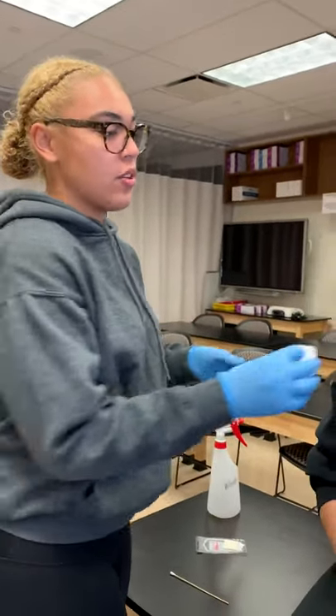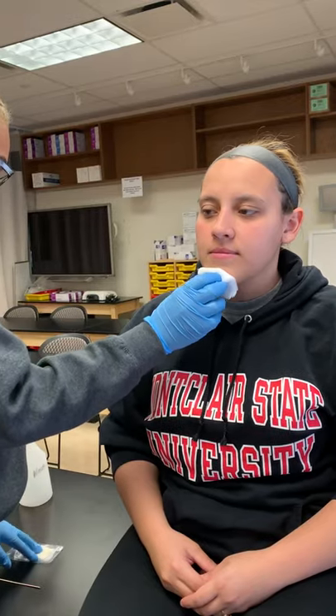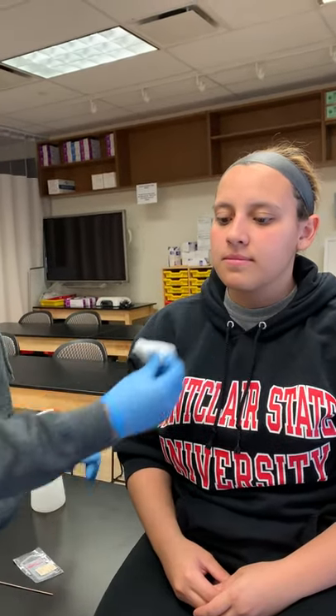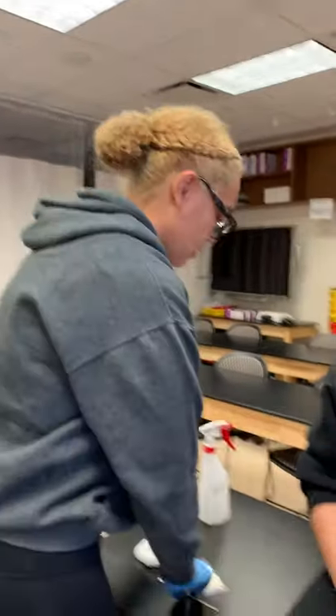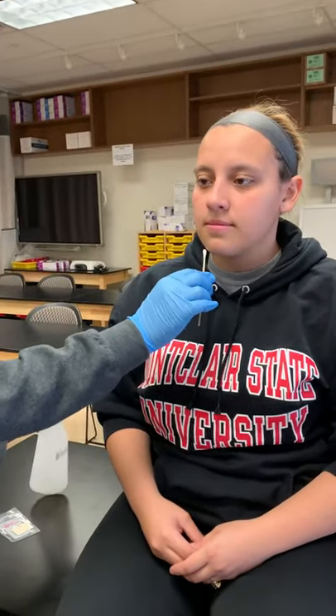We're going to apply some Steri-Strip right here and stop the bleeding. Once the bleeding is stopped, we will clean off the area. Then we're going to apply some adhesive to make sure they stick.